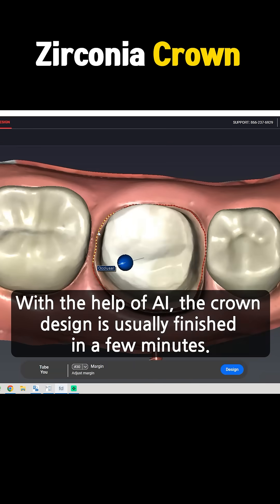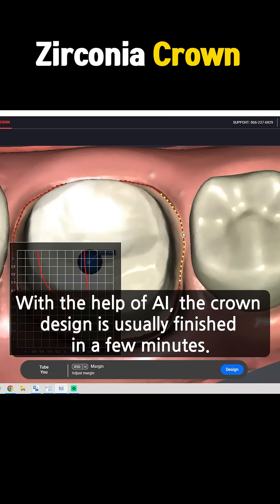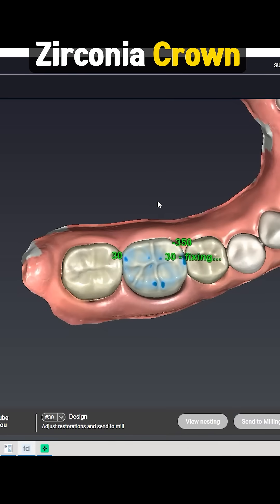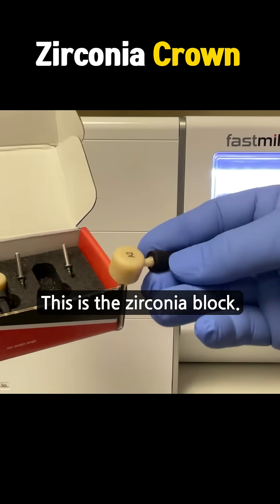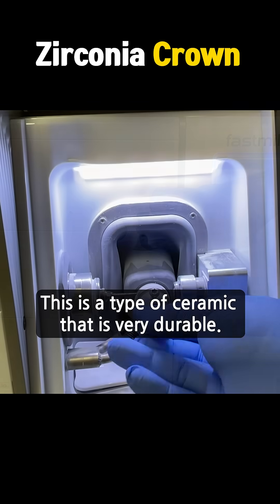With the help of AI, the crown design is usually finished in a few minutes. This is the zirconia block — a type of ceramic that is very durable.